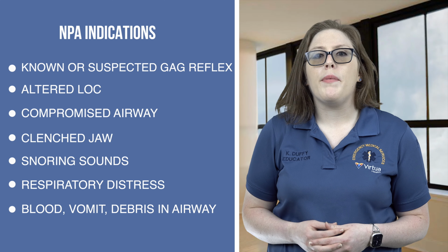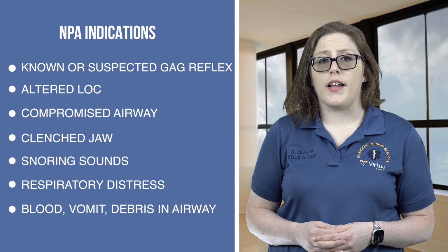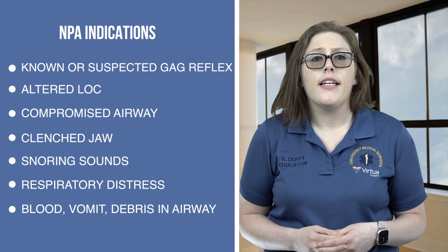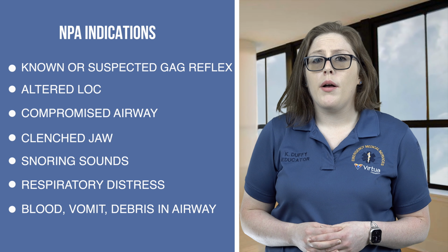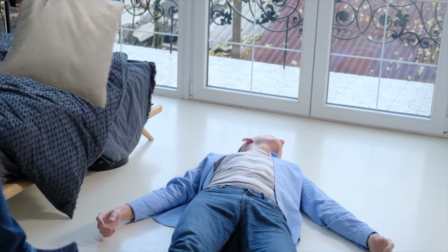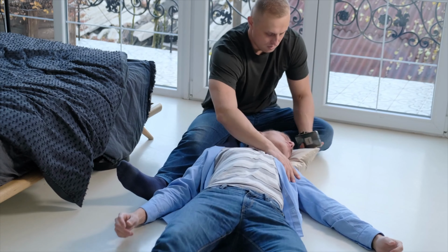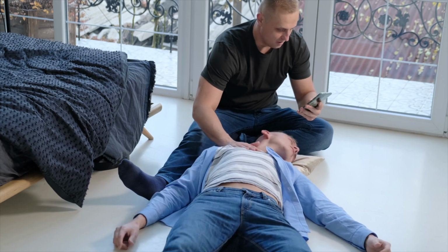Indications. An NPA is beneficial for patients who present with a known or suspected gag reflex and an altered level of consciousness. The patient may present with evidence of compromised airway, such as a clenched jaw, snoring sounds, respiratory distress, blood, vomit, or foreign matter in the airway. One excellent example of a patient that typically requires an NPA to eliminate airway compromise is an unconscious seizure patient with irregular, labored, and shallow respiratory effort.